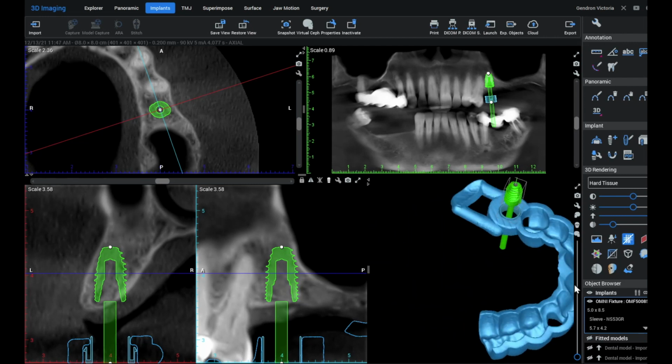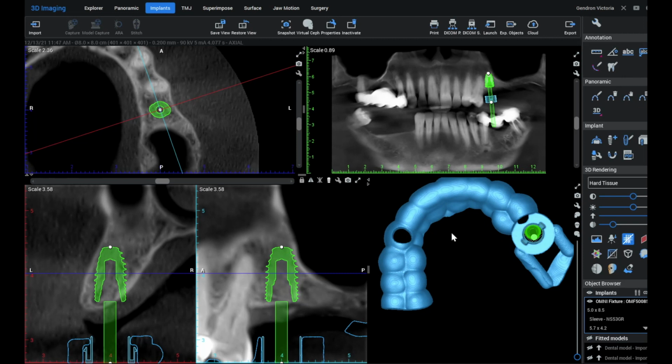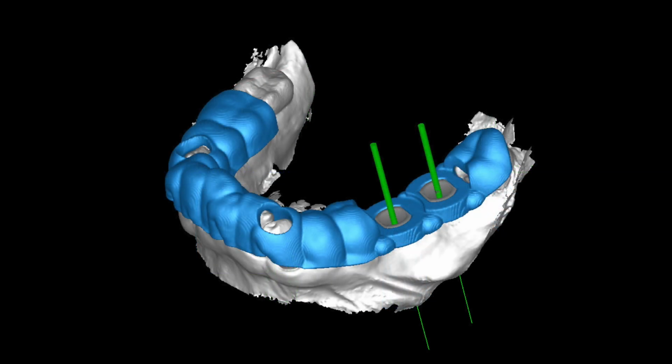But this is it. This is a really simple method to sort of hedge your bets and eliminate some of those risks. Whether you're doing it flapless or flapped, this will really help. So in an ideal world like this case, we would be having posterior support from a third molar, but that's often not the case, and therefore having some support, whether it be on the tuberosity or the retromolar pad, make sure you include that space in your intraoral scan if you can get it, and this will allow you to have this posterior support to eliminate risk, especially in cases where you might be getting close to the mandibular canal, where you just don't have any room for error.